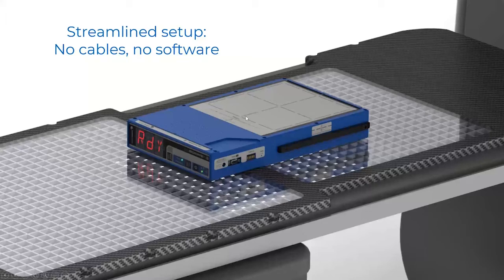Then your laser lines also can be checked to verify that the lasers are coming in here at the right distances. And we've also got some markers back here and back here on the device to make it easy to line up that sagittal as well. So I'm all set in position.